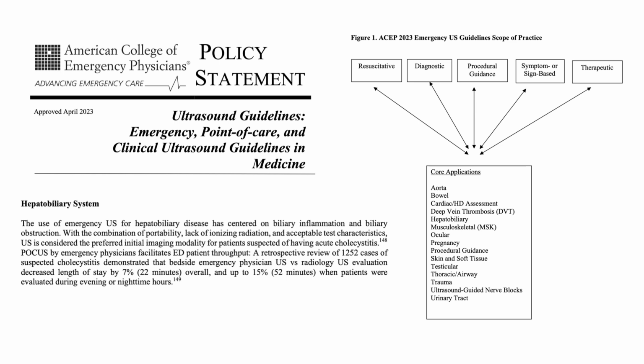And then obviously there's been over the years a lot of research and a lot of development of additional modalities, but one of the core modalities, one of the original modalities of bedside ultrasound from a diagnostic standpoint, is hepatobiliary ultrasound. And they say here it's because it is kind of this ubiquitous thing, right? It's portable. There's no ionizing radiation, and the test characteristics are actually really good for ultrasound in general. And subsequent studies have shown that ED physicians are pretty decent at doing this ultrasound as well, to get to a very, very accurate diagnosis for these patients.